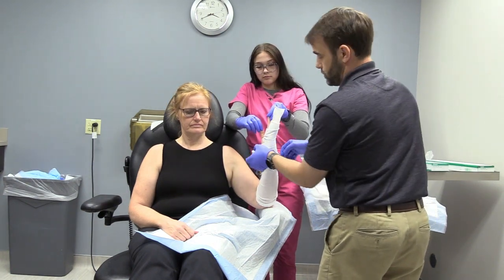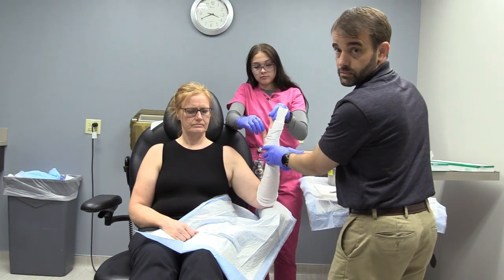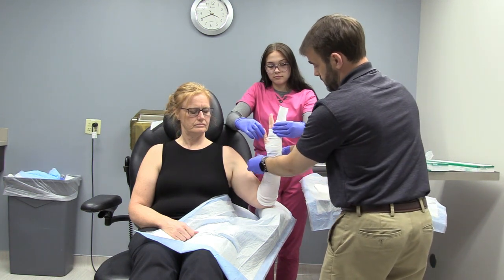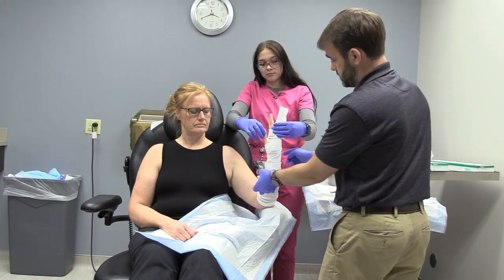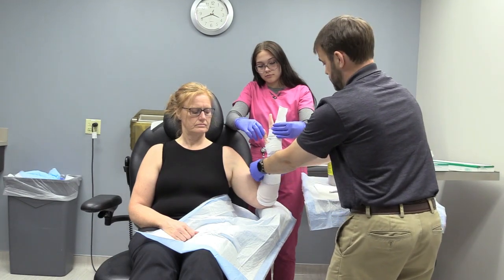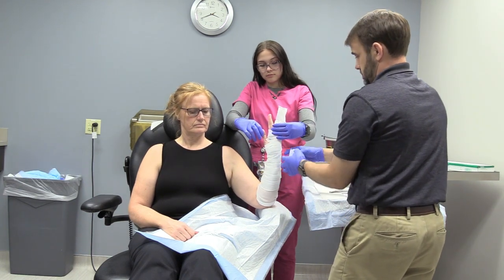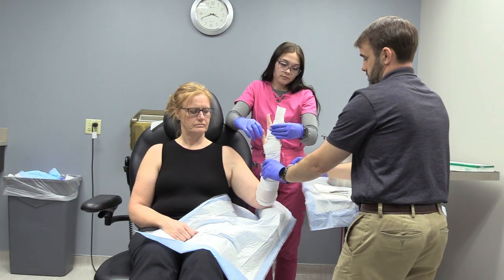You don't have to be incredibly fussy with how your padding is placed, other than you don't want it to wrinkle up too much to cause a pressure area, and you just want to make sure there's enough of it to keep the plaster from irritating the skin or pushing on a bony prominence. So the ulnar styloid is particularly important. Through the forearm, it's less so important because you don't have bony prominences there. And then I'll usually lay some along the ulnar styloid itself.